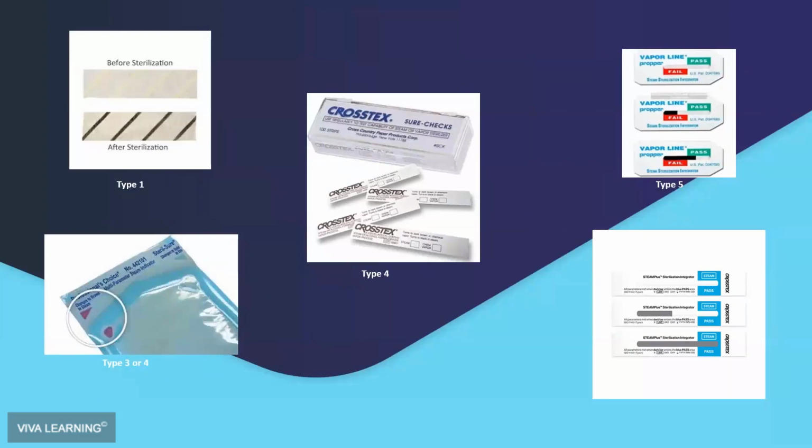With the types of materials we have for pouches now, studies have shown that even after 2 years, the instruments can remain sterile inside of a sealed pouch if the pouch is sealed appropriately and the instruments were not taken out of the sterilizer until the packaging was dry before they were put into storage, and there's no perforations or punctures, no instruments sticking out, which can compromise the sterility of the instruments inside, exposing them to room air.